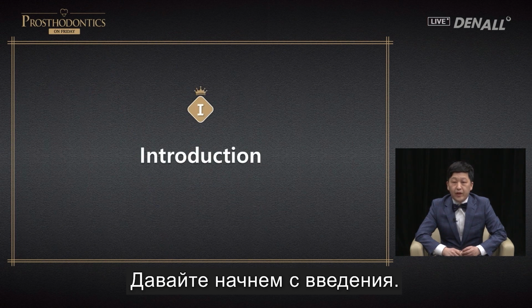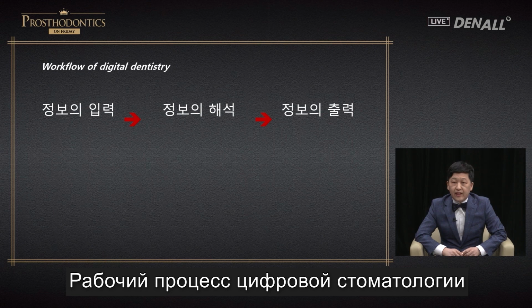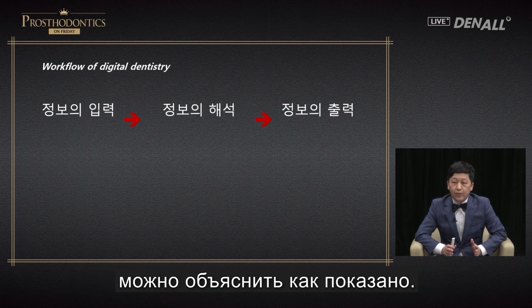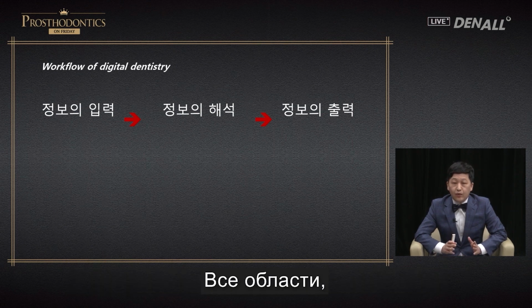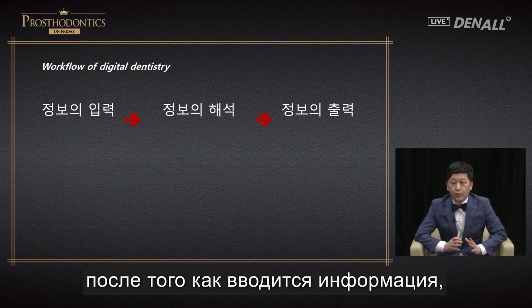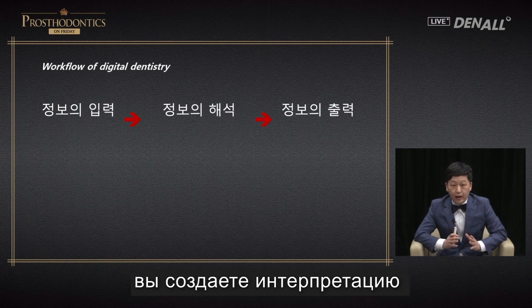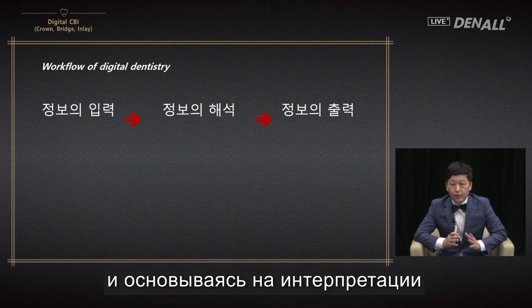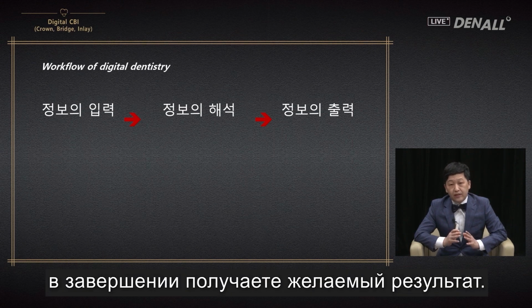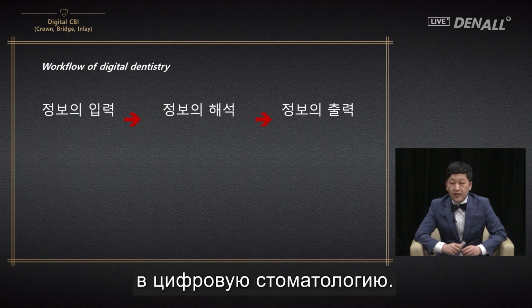First of all, introduction. The digital dentistry workflow can be explained as shown. In all areas which encompass digital technology, once information is input, you make an interpretation based on the information, and based on the interpretation, finally, the desired output is gained. There are 3 steps as mentioned. And what kind of steps are included in digital dentistry?